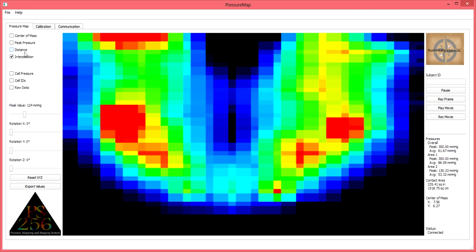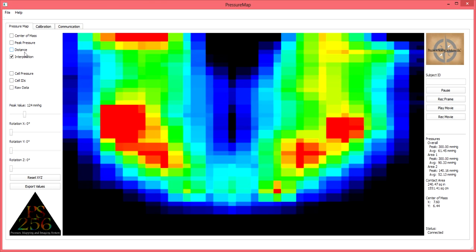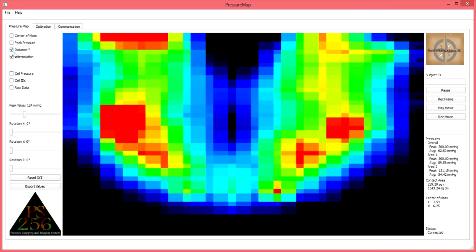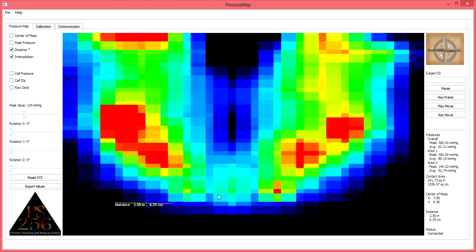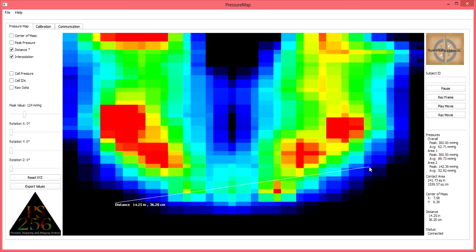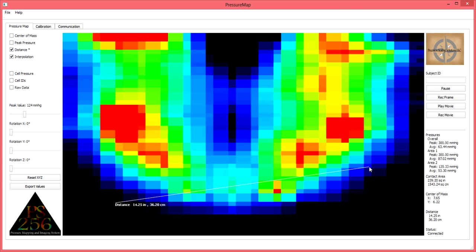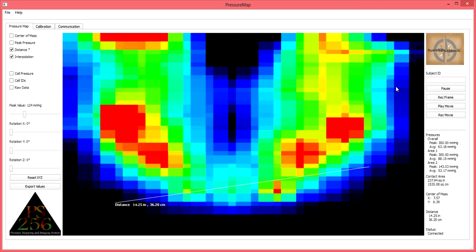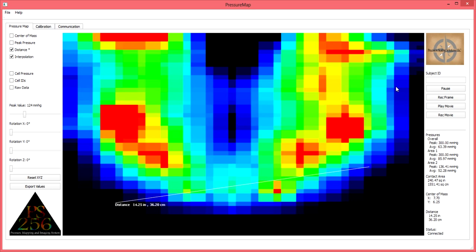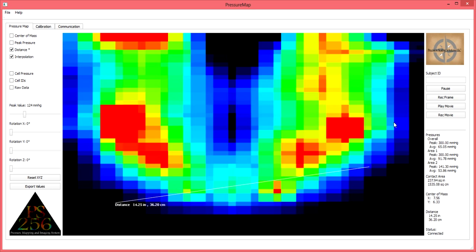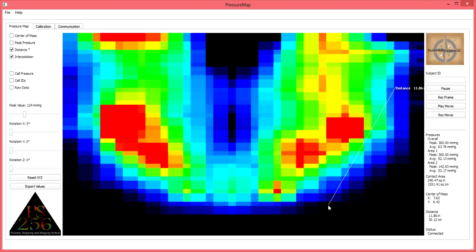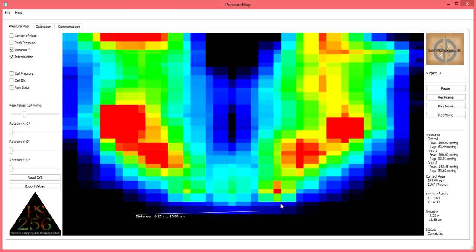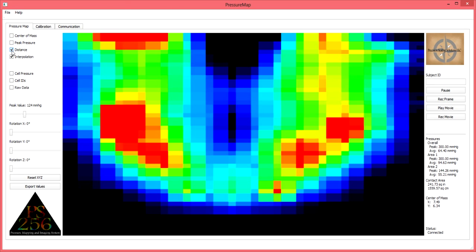A distance tool is also helpful with clinical application and evaluation. When the distance tool is selected, simply click and drag the left mouse button to take a linear measurement on the display screen as you see here. With the linear display feature in effect, a linear distance will be measured in both inches and centimeters.